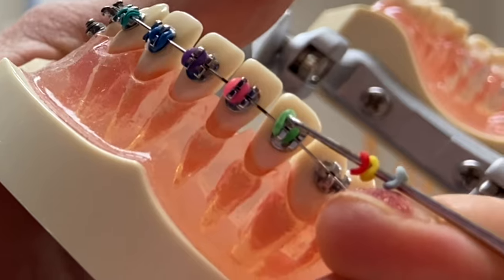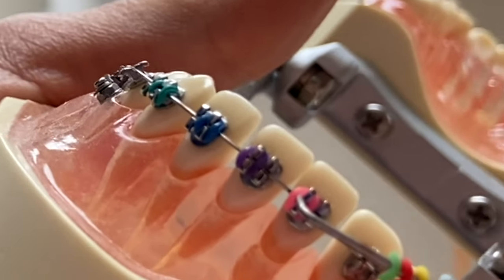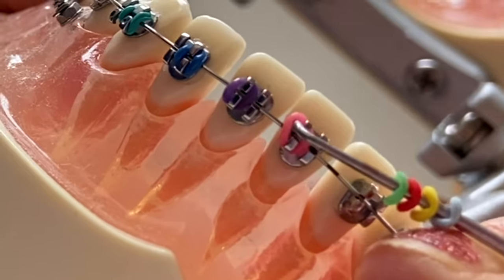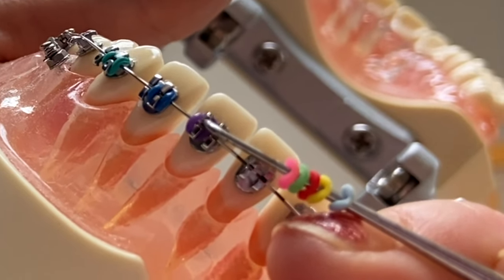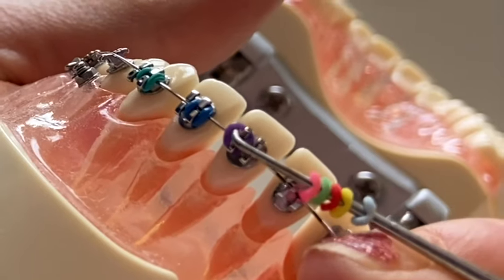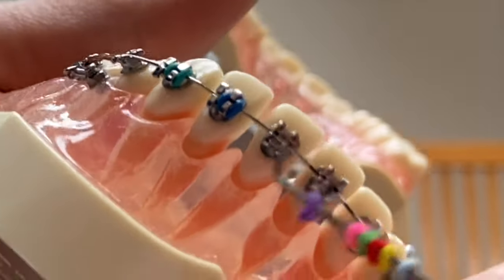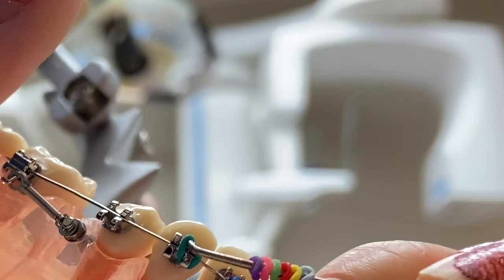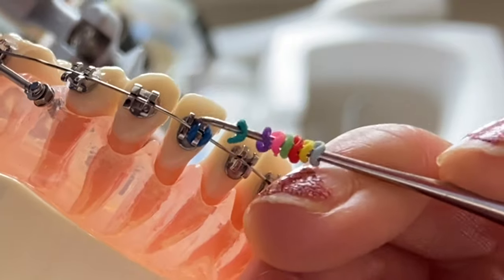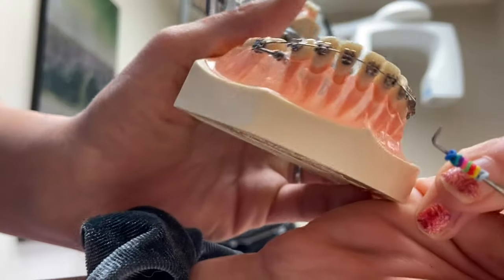So you can see what I'm doing — you're going to go up and down. To the side, grab a hold of it, and then up. Never pull out — always go up, down, toward the wing, if that makes sense. So up and down. Got a nice little rainbow going on. Let's keep going. I might have to go to the other side sometimes. And voila, they're all off.